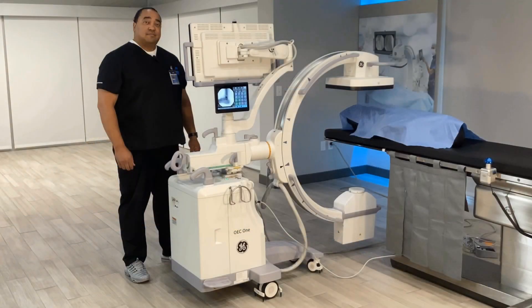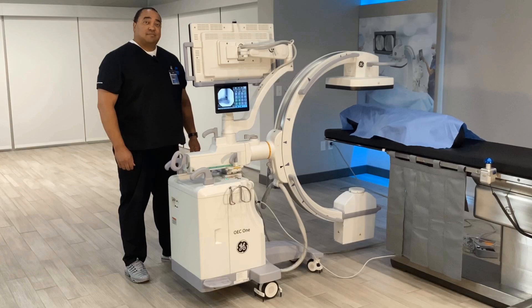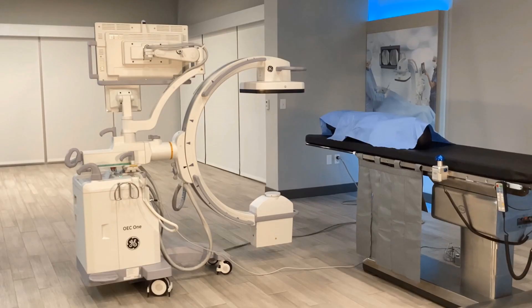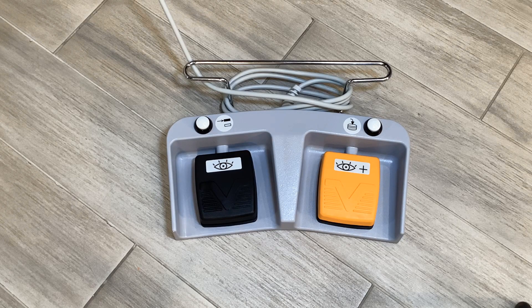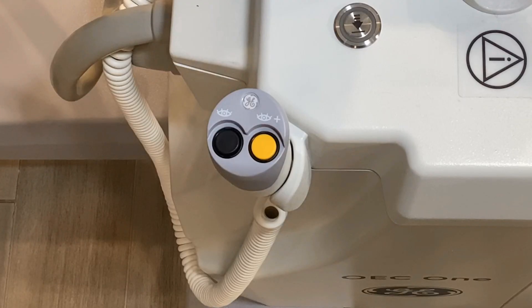Hello, my name is Kevin Paul and I'm a Clinical Imaging Specialist with GE Healthcare. And my name is Allison Cook. In this video we will review how to use the OEC1 CFD footswitch and hand switch.